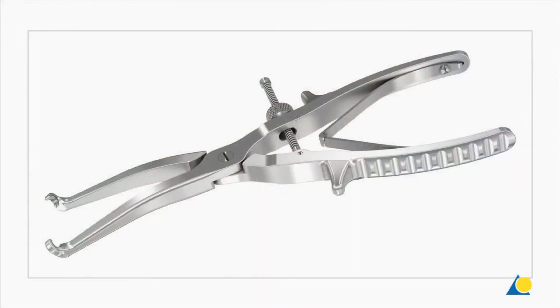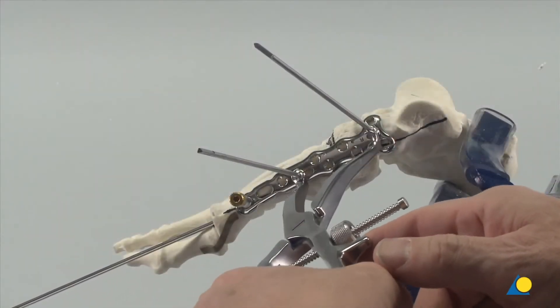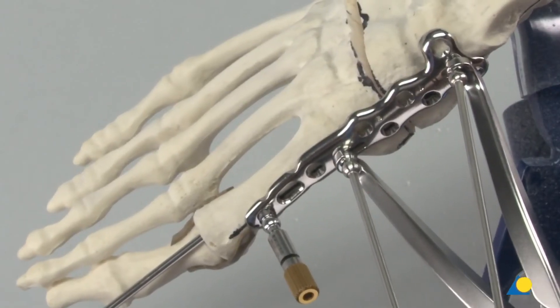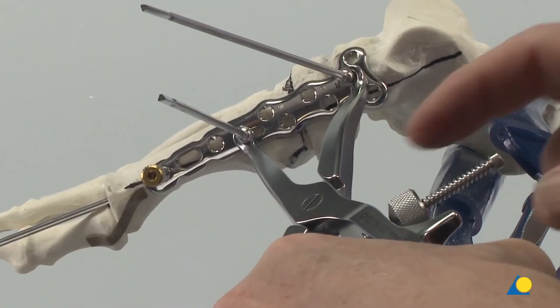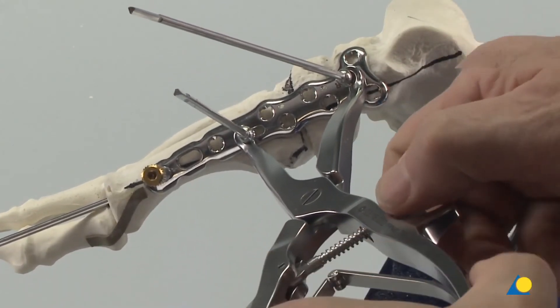The osteotomy will be compressed using the compression forceps. To do this, the speed nut is threaded counterclockwise so the forceps are in their open position. The forceps are positioned with the tips around the spheres of the compression wires. The handles are squeezed to provide the desired compression, and the forceps are locked by threading the speed nut clockwise.